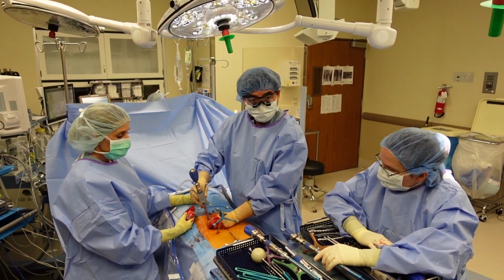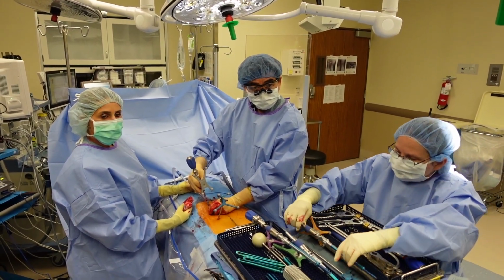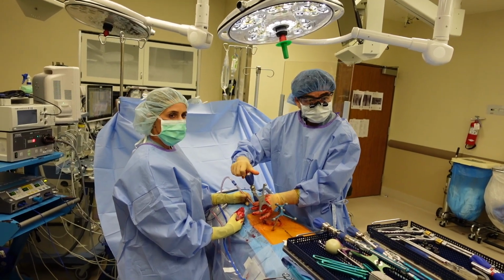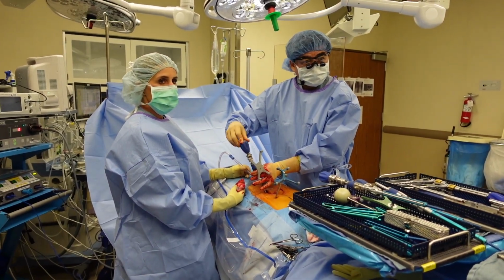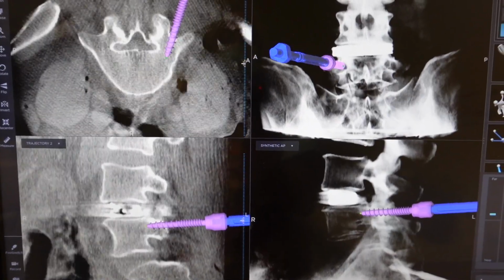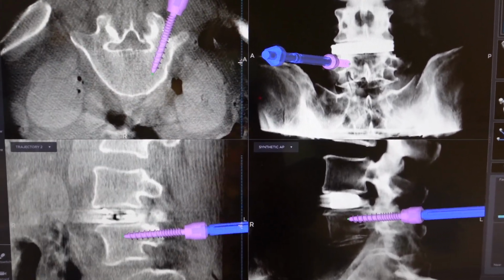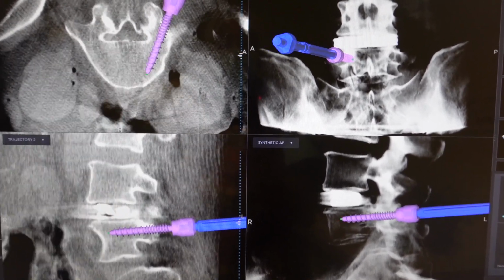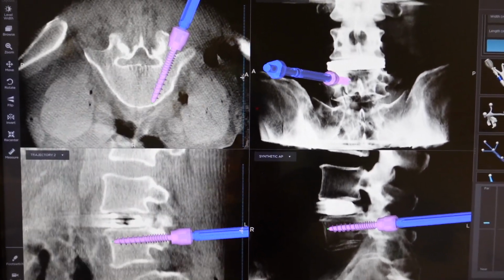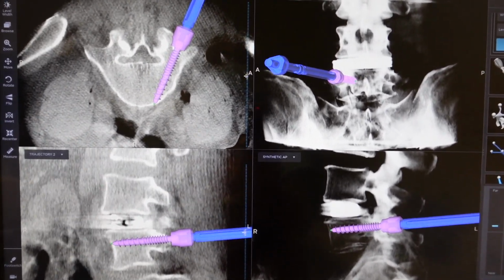I made the holes on all 4 at once. And it is amazing how easy it is to find this hole again. It's going to be a perfect screw too. Now for the screw, this definitely pulls you in. I'm not pushing at all. Oh yeah, it's a good bite too. It's cheating, I know, but like my mom always said, if you don't cheat every once in a while, you ain't trying hard enough. Oh, that is a good bite. Thank you for having such great bone.